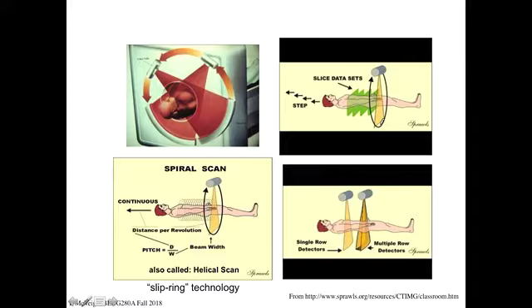That came out on a ribbon cable into your signal processing device. The ribbon cable, obviously, if you go around the patient 360 degrees, well, it can't just keep twisting, right? So you would do 360 this way, then 360 that way, then 360 this way, then 360 that way. Because this cable had to go around and then come back, and it was all very sophisticated on how they had the cable set up. And then Siemens was the first vendor to introduce slip ring technology.